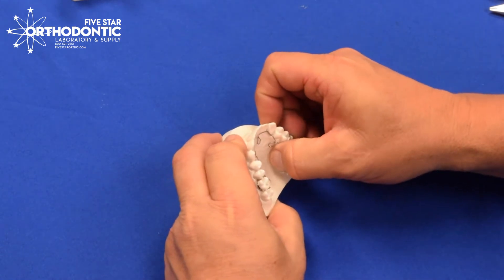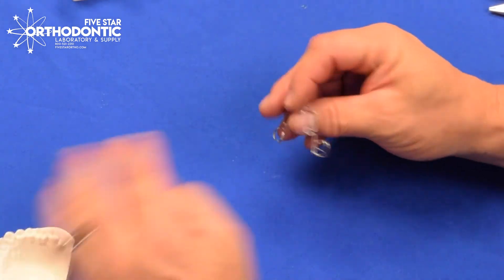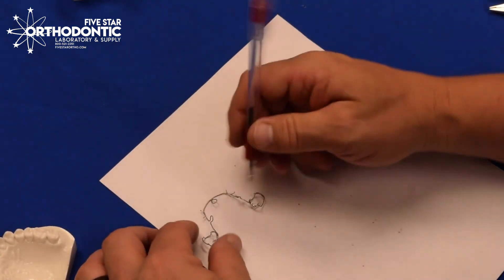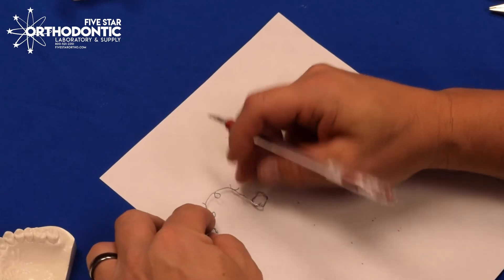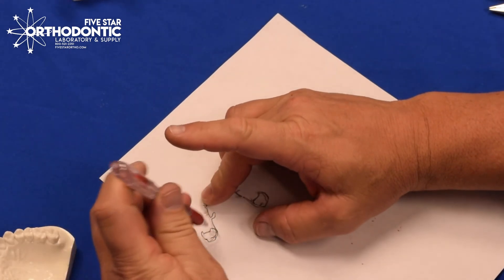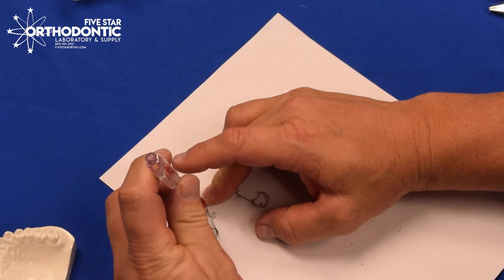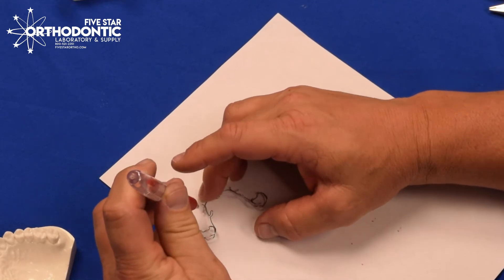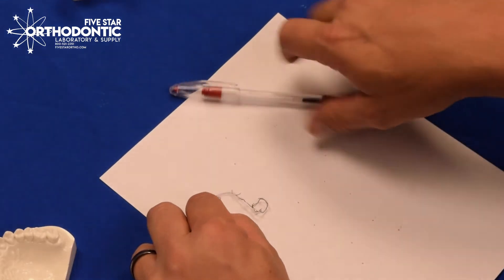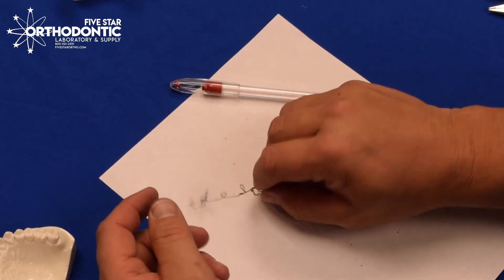When you first get the appliance, it will be passive. Take it off of your model and place it on a piece of paper. Mark the tip of the rest on one side, hold down, mark the tip of the rest on the other side. In the front, you can go right at the body wire in the center of the crescent on the cuspid. Then mark on the other side. Now you know where the appliance started, so if you over-expand or under-expand, you can go back to where it started.